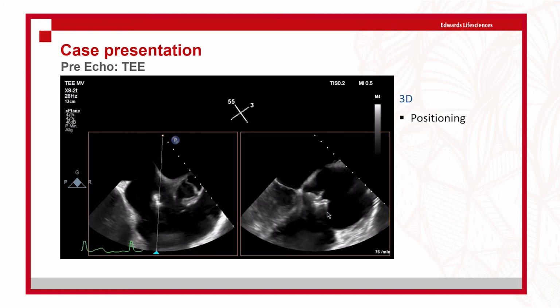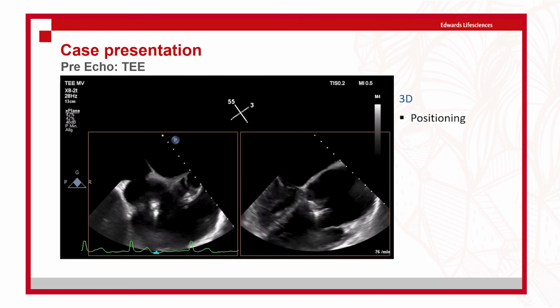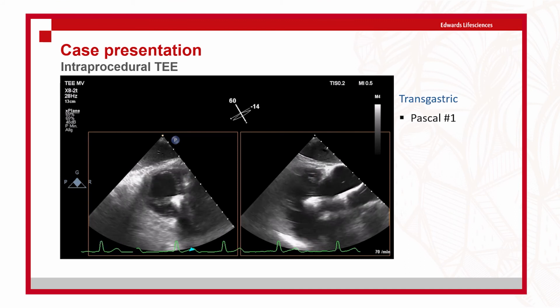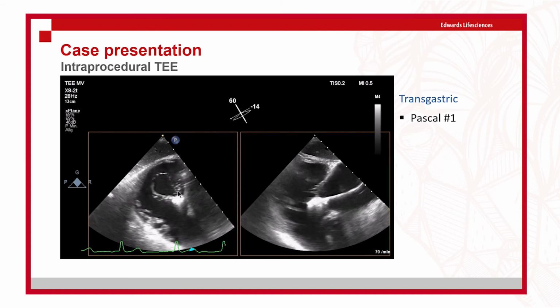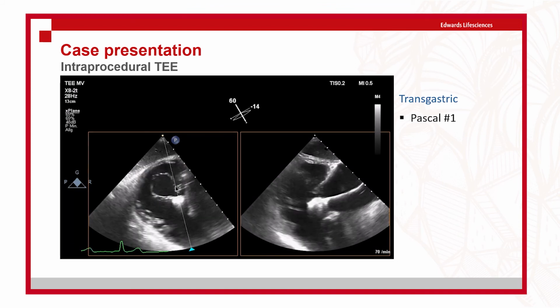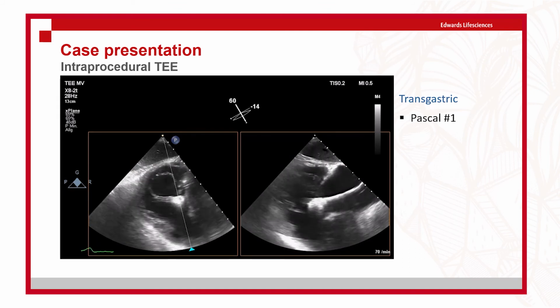Here we have a 4-chamber view where you can control separately the septal clasp and the anterior clasp in this patient. Transgastric views have been shown nicely, and we also use this to close the device, which you can see here. You can nicely see how the leaflet edges run into the PASCAL device, and that we get an approximation of the gap that had been in the range of 4 to 7 millimeters in this case.